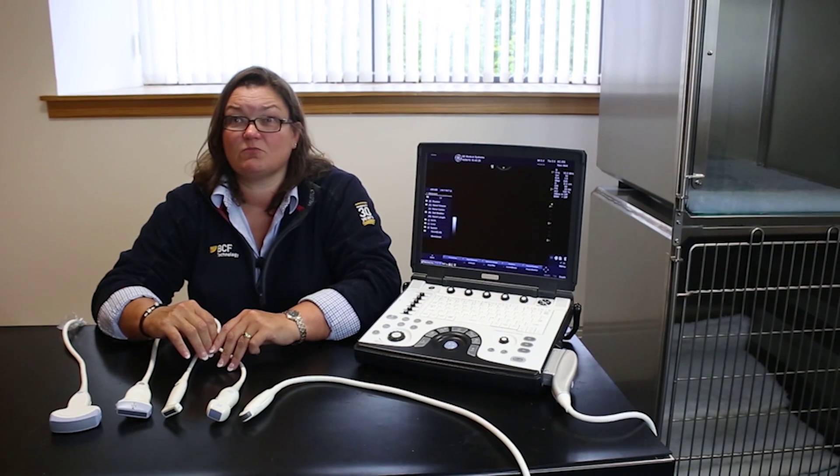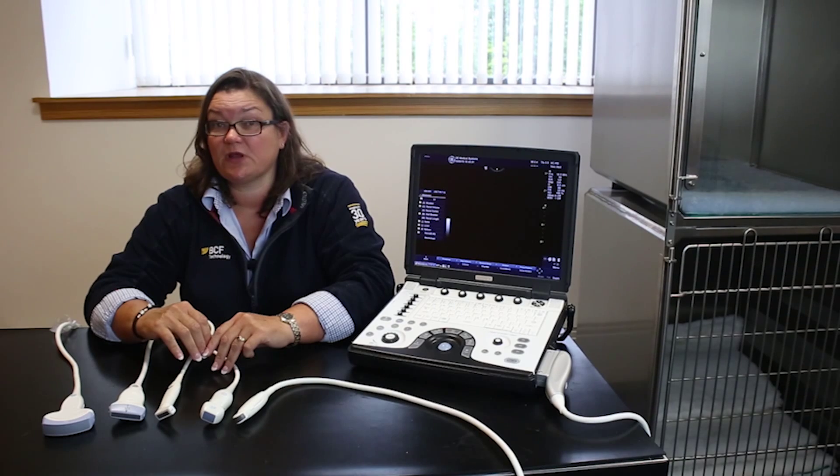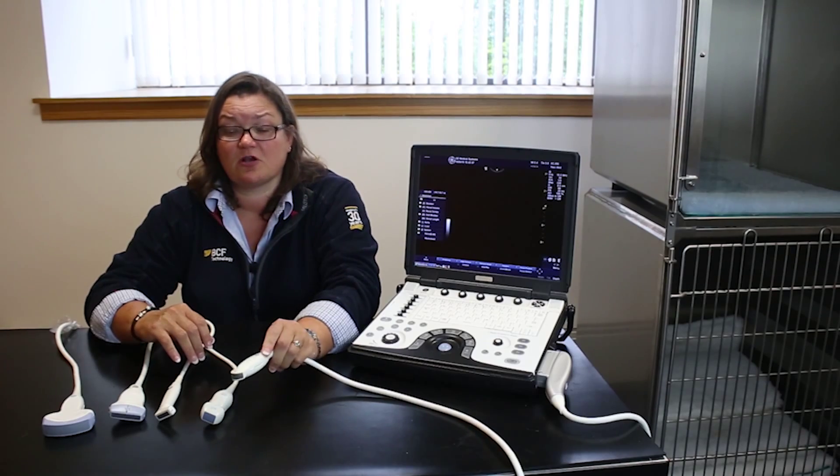Now let's talk a little bit about the more commonly used probes that we have on the Logic E ultrasound system. In small animal practice, the vast majority of your abdominal work is going to be possible with the little 8c microconvex probe.